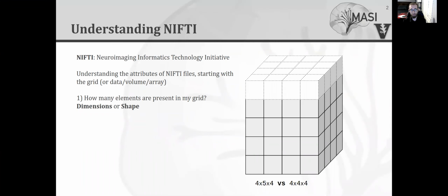So to talk about tractography, I really need to talk about the Nifti file first. So it's a way in to the tractography in the rest of the talk. So first important thing to know about the Nifti file format is that it's a neuroimaging multidimensional array file format.